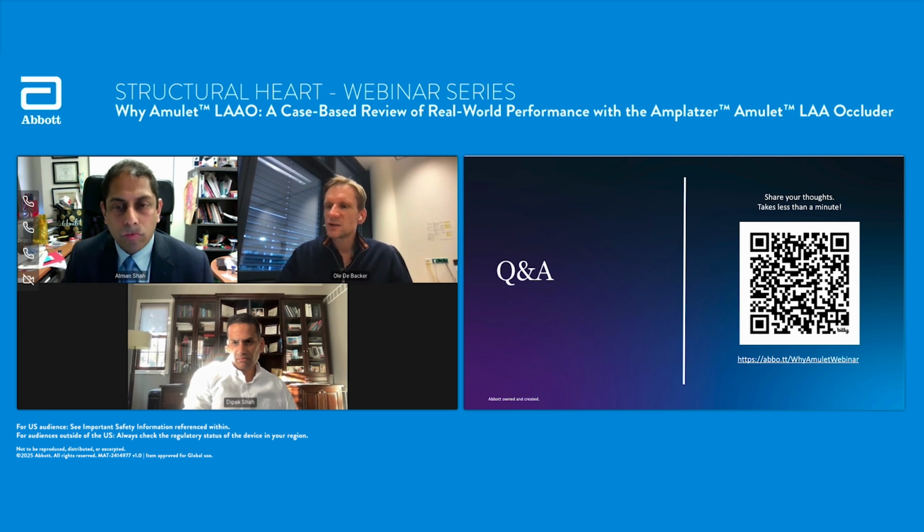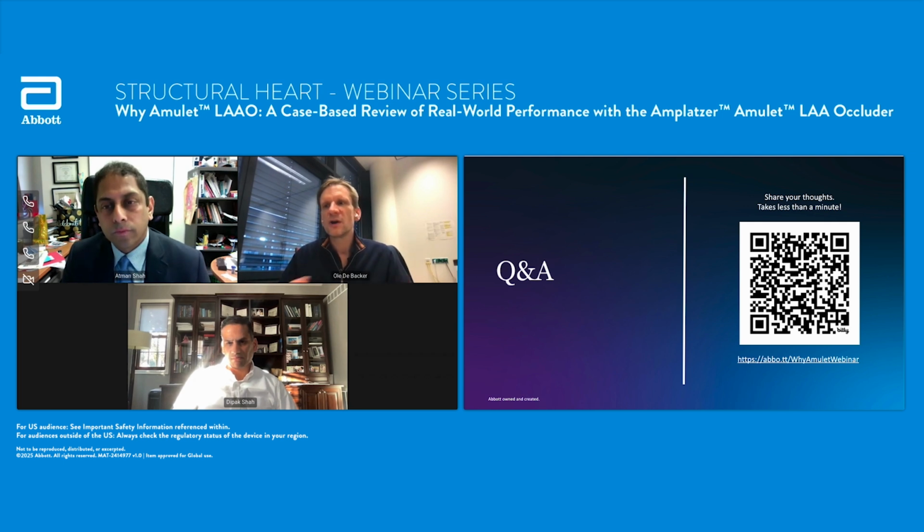Of course, what is the advantage of using 3D or 4D ICE? That's when you don't have cardiac CT up front, when you don't have any 3D imaging up front. Of course, it makes sense that there you need some reliable sizing still of your appendage. And there, the advantage of 3D ICE really is that you go into the left atrium, and you can make a multiplane reconstruction of your LAA. So that's the key.